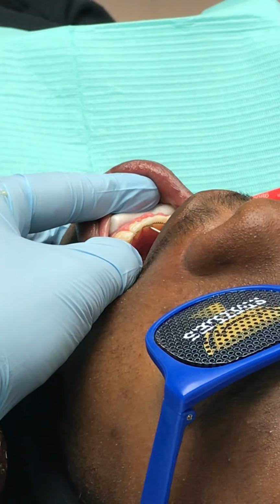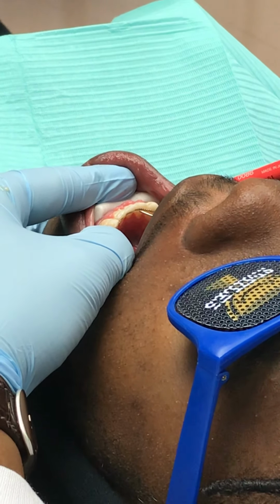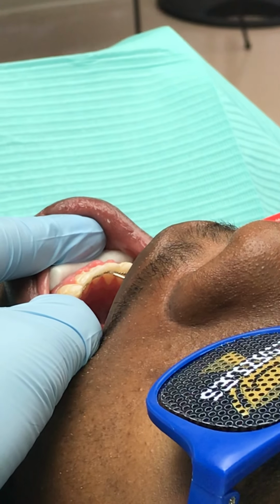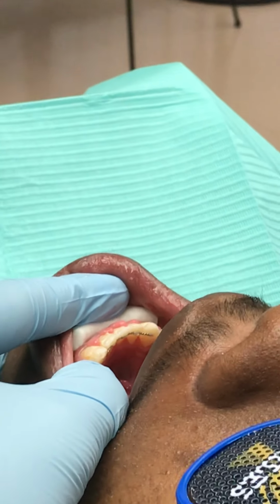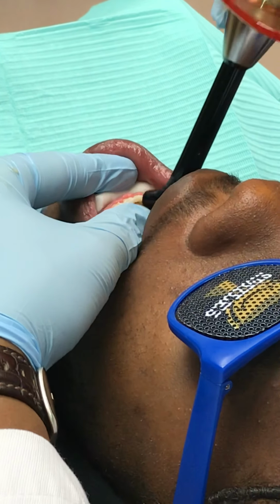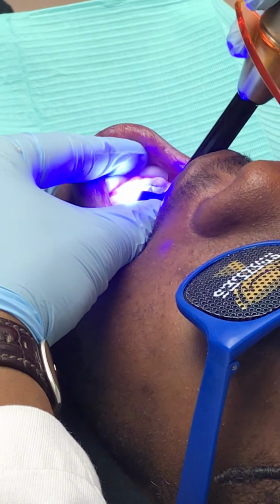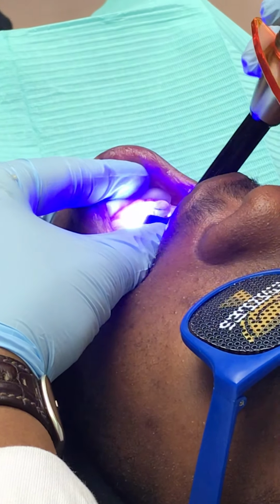One thing that I didn't specifically verbalize is the purpose, when you add that 3rd stripe. You go gingival, and then you go incisal with the adhesive, and then you add that 3rd stripe right over the wire. This adhesive has capillary action as well, which basically allows the adhesive to flow from the gingival to the incisal. In other words, when we add the 2 layers above and below the wire, and then we add the 3rd layer right over the wire, the material will kind of flow all by itself and connect the 2 stripes that you already placed.